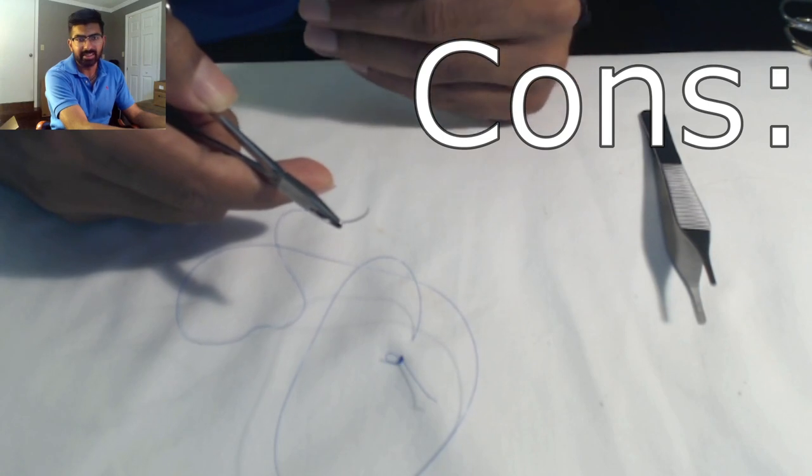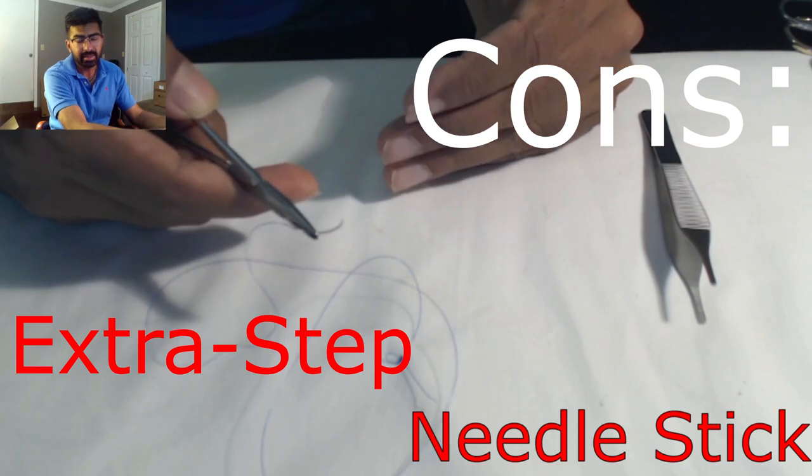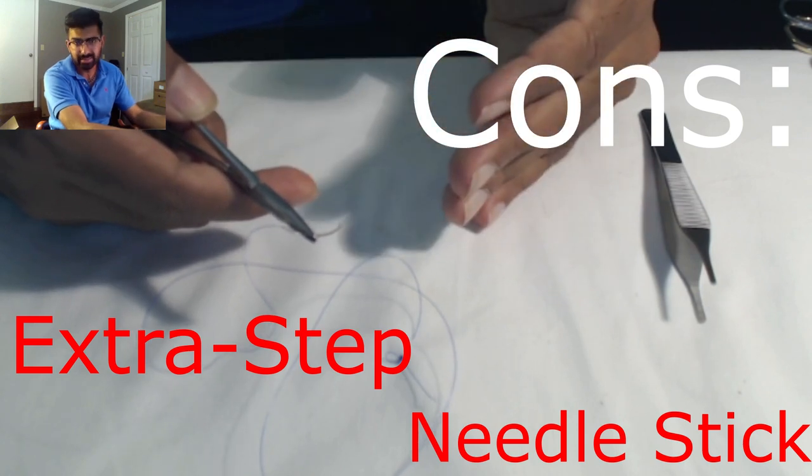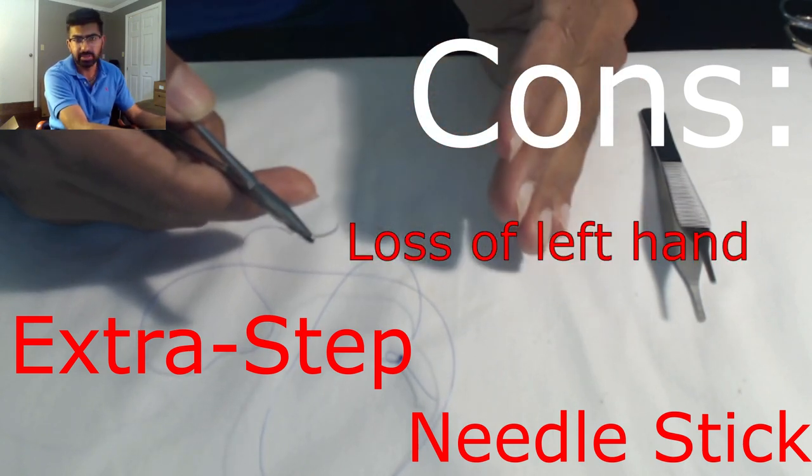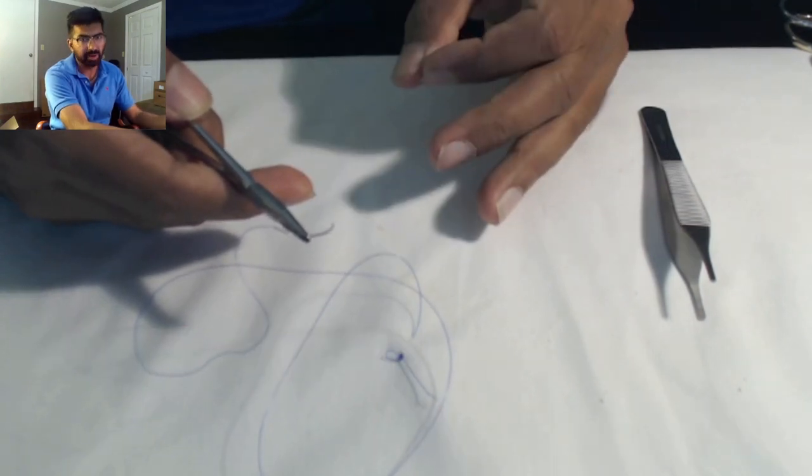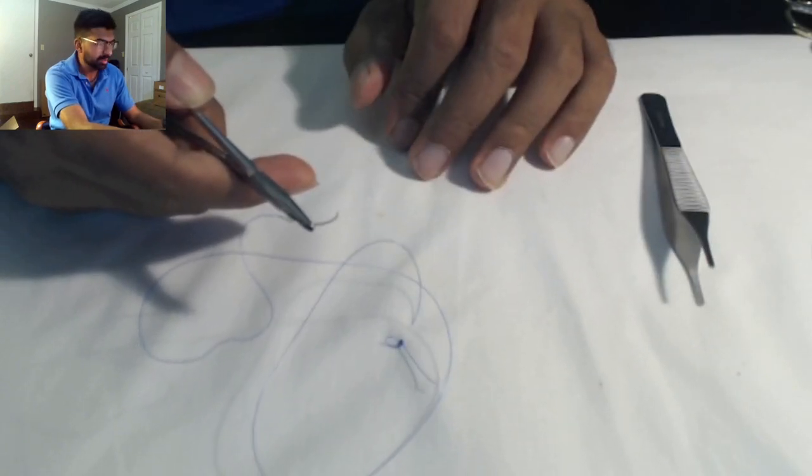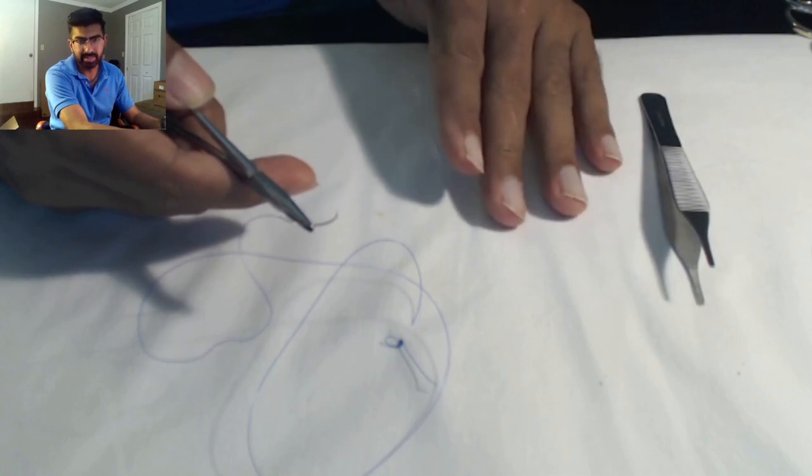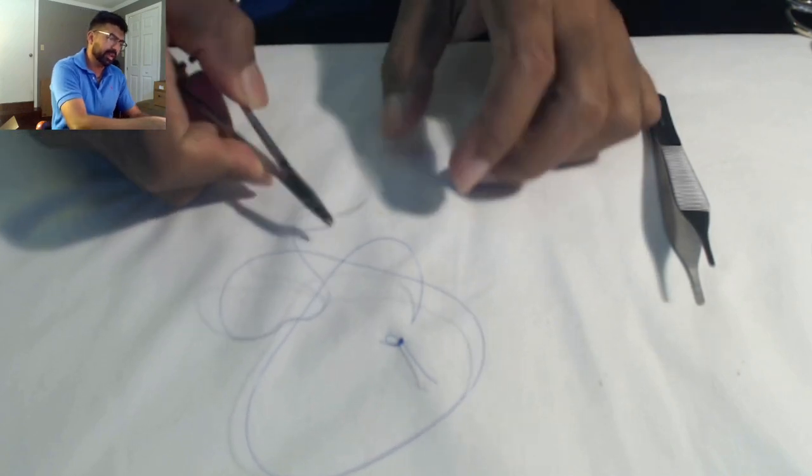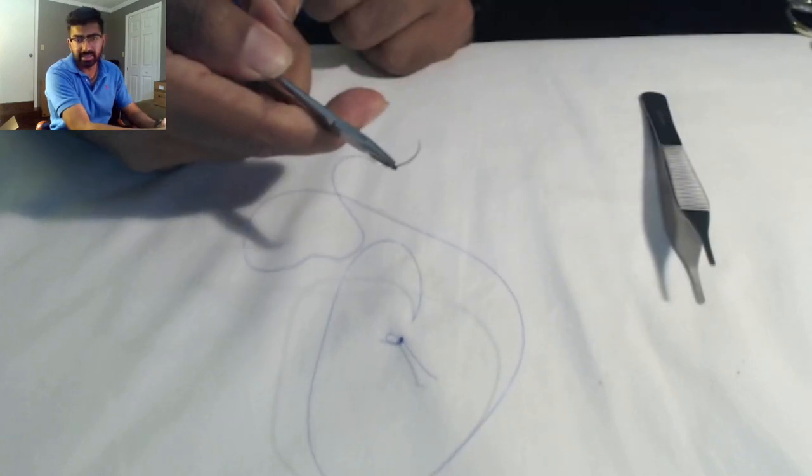The downside is it's an extra step. You're putting your hands in there, putting them at risk for injury. If you stick yourself, that's an infectious risk. If you were using your left hand for retraction or keeping tissue held, you lose that ability. But the big perk is you can get the needle set exactly where you want it. I see most medical students and interns doing this when they can't get the angle just right.